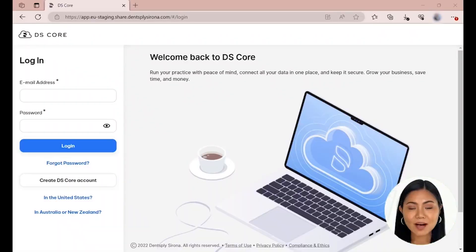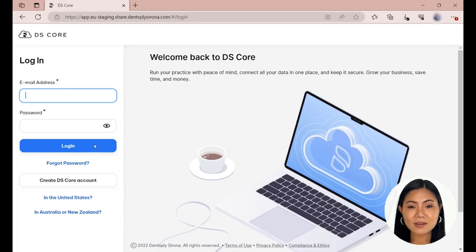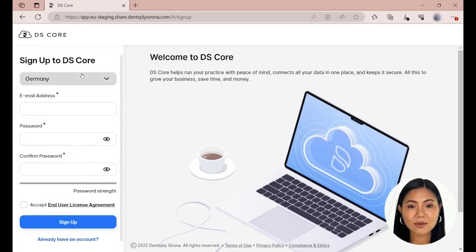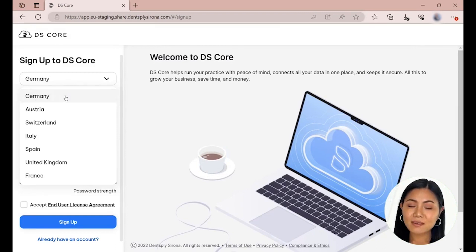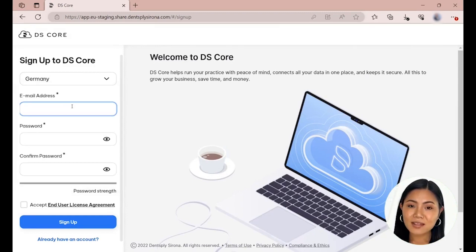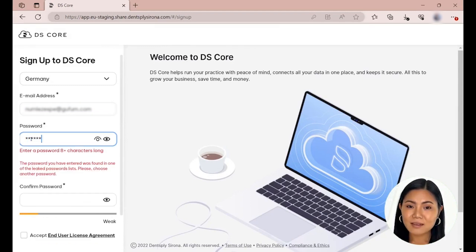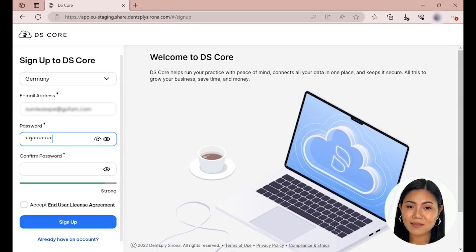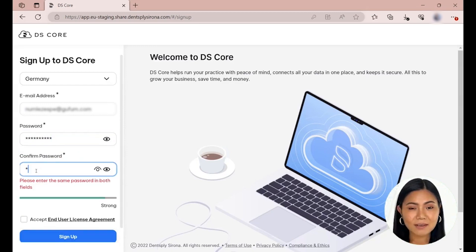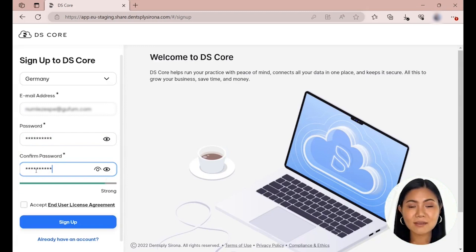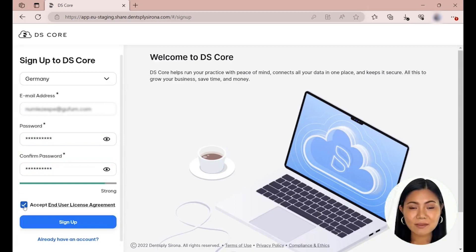Open a web browser on your computer and go to dscore.com and select Create DSCore Account. Select the country in which your laboratory is located from the drop-down menu. Enter your email address and choose and confirm a password. Accept the end-user license agreement by clicking on the box, then click on Sign Up.